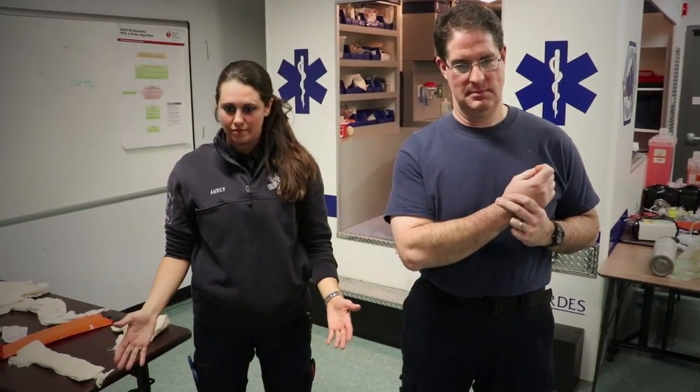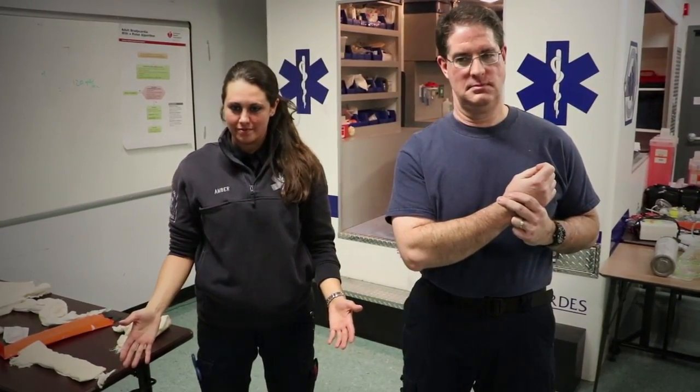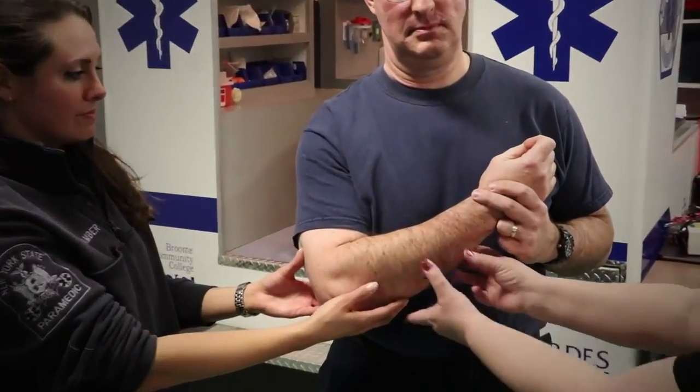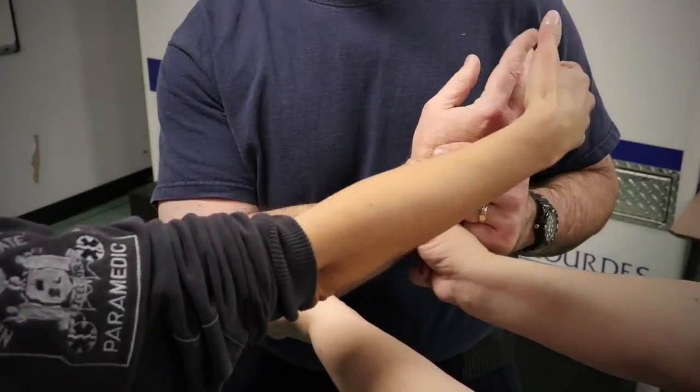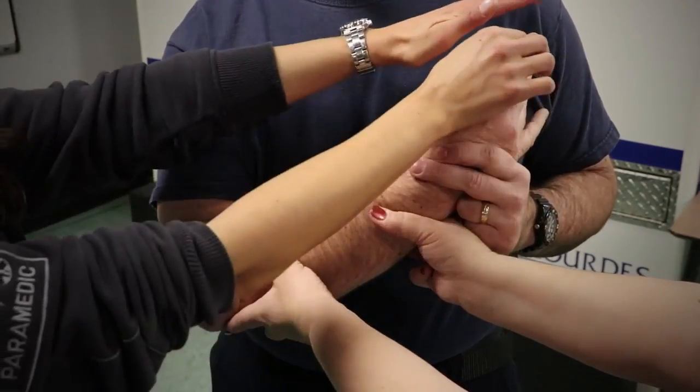Takes or verbalizes body substance isolation precautions. Directs application of manual stabilization of the injury. Assesses motor, sensory, and circulatory function in the injured extremity.